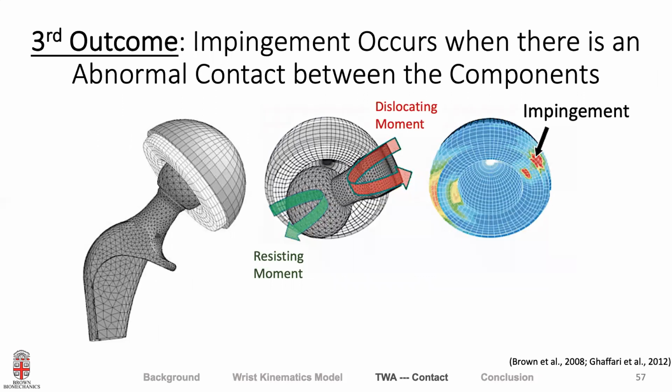Lastly, the hip and knee joint replacements have been studied at the contact level. For the knee, these studies have led to designing joint replacements that mimic the rollback of the knee, for example. For the hip, the studies found the problem is impingement, and impingement happens when something prevents the smooth motion of the joint. For example, here for the hip, you see it's trying to go down, but it can't because of the inherent feature in the design, so it creates impingement.